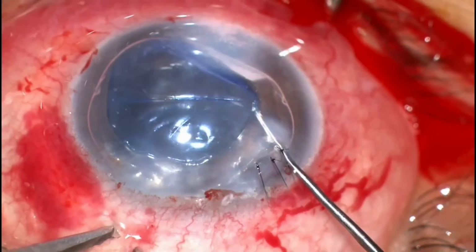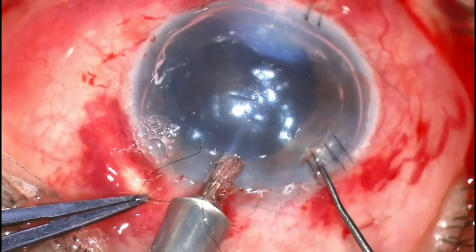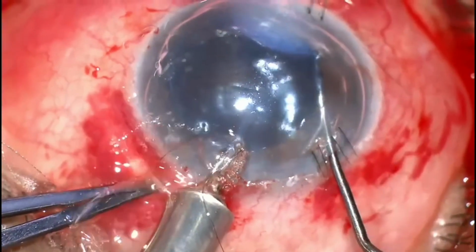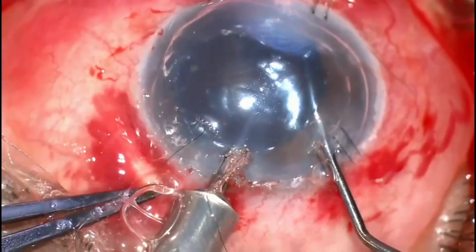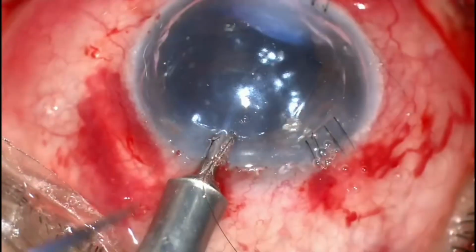And the advantage here, again, like I told you, in a PDEK you can always manipulate the graft, especially at the edges, because it's easier to drag the graft. And once your main port and your side port are sutured, you have a secure airtight chamber, and that's when you close.